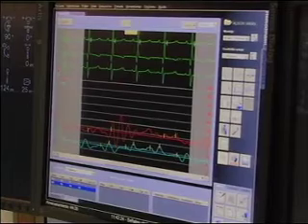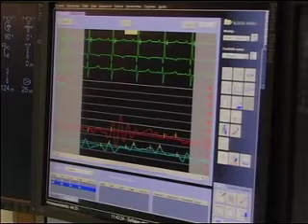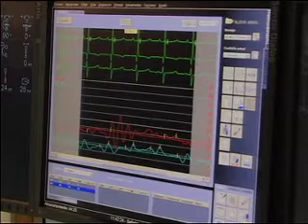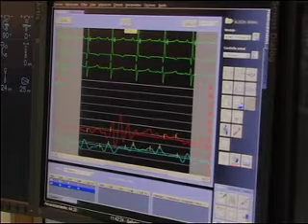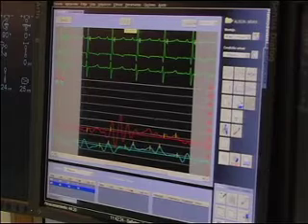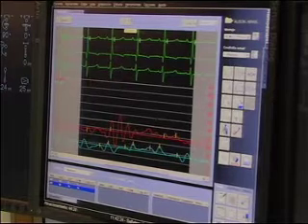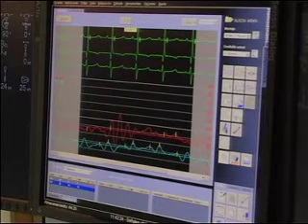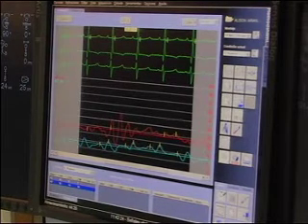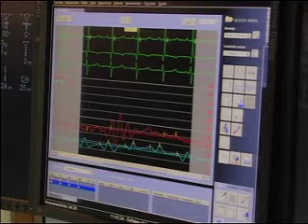So we have several plans right now. I'll show you in a moment the transesophageal images too. But we have 3 plans. The first plan is to do nothing, because I think these are good pressures. The patient is only 12 kilos weight, and I think we will not perform the Fontan operation until next year or something.